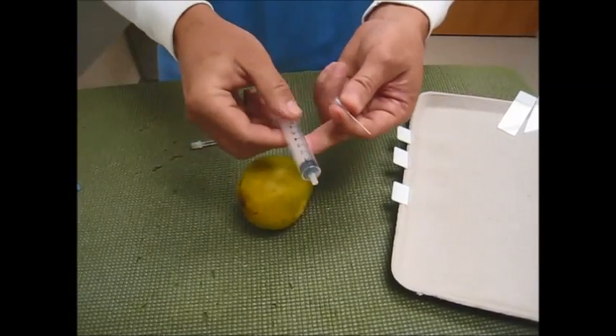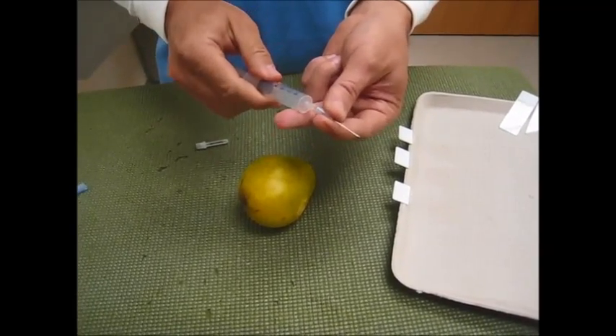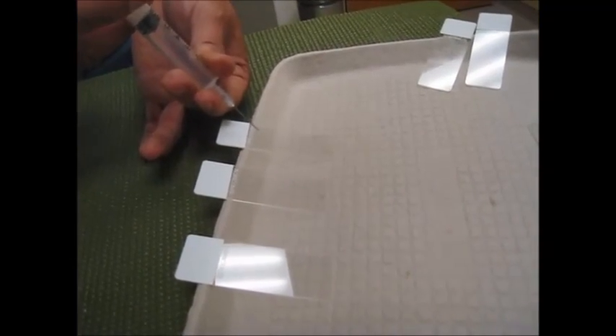Then take your syringe, pull the plunger back so the syringe is full of air to approximately 6 cc's, attach your needle, place it close to the edge of the slide, and in one forceful motion eject the aspirated material.